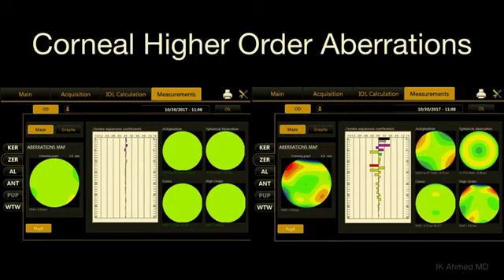to identify patients that may have had previous LASIK. A lot of times people have had previous refractive surgery. They don't tell us this, and we get fooled. I like looking at asphericity and looking at the spherical aberration and the corneal topography to tell us what may be going on. But for many patients, what their other value is, is lens selection.